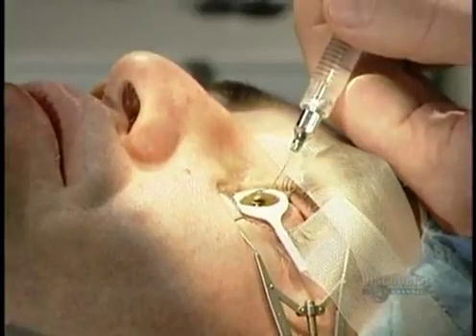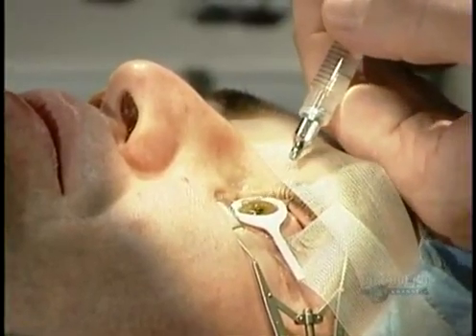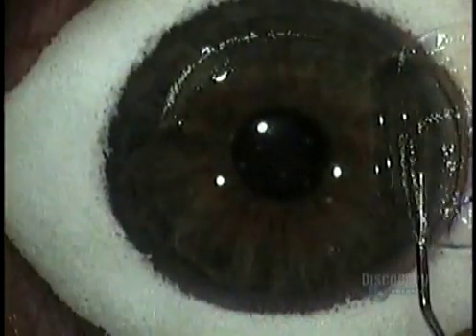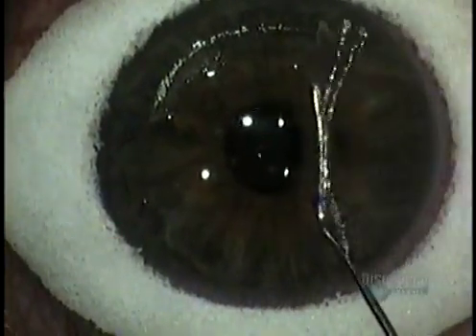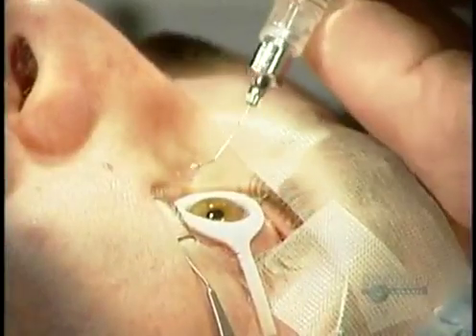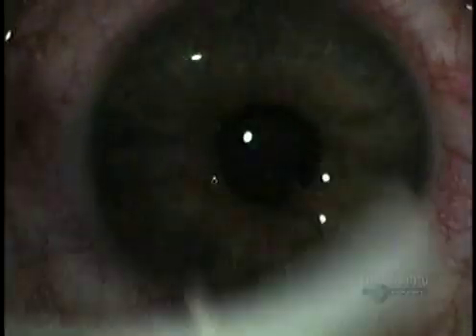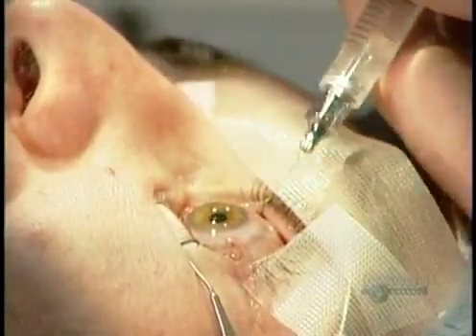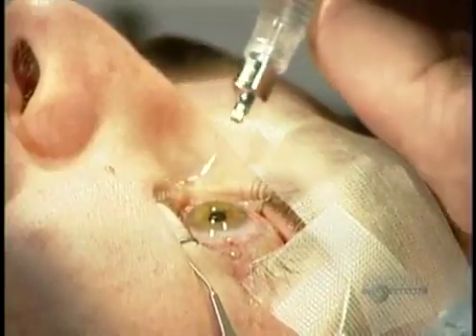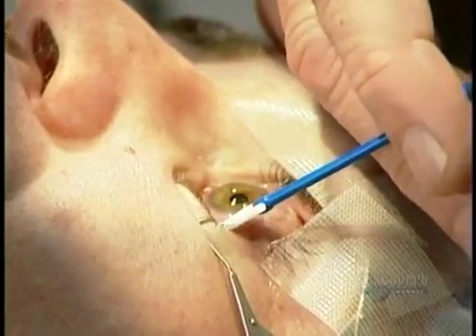The surgeon removes the sponge and then, using those little ink marks he made earlier as reference points, folds the flap back to its original position. If the flap isn't precisely where it was before, the patient will have distorted vision. Using a syringe that flushes the area with sterile water, the surgeon carefully smooths the flap, the same way you'd smooth out a tablecloth. Then he removes the sponge ring. Within 45 seconds, the negative pressure inside the cornea sucks the flap back on — the flap literally seals itself.